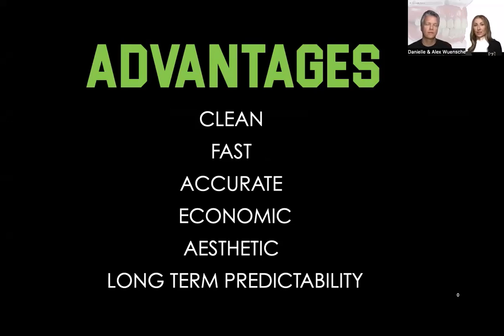So for that reason, it's more economic, I would say, right? Yes. It's more economic in terms of the maintenance over time. There's nothing that has to get changed out in the attachments like nylon caps or so on. It's pretty much maintenance free other than cleaning it, except after 4 or 5 years, like on any other implant reconstruction, we have to change the teeth because the teeth are acrylic teeth, like in an overdenture. So the teeth have to get changed. They're made to wear, so the teeth will wear over time. So they have to get changed, let's say after 4 or 5 years, at the latest, right?